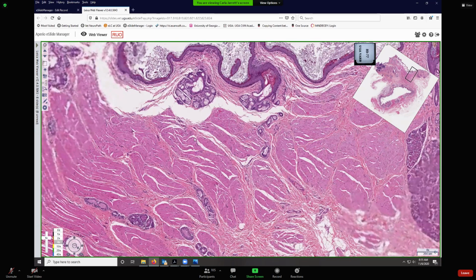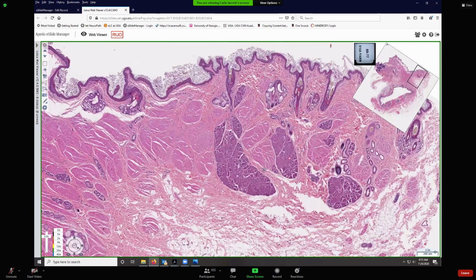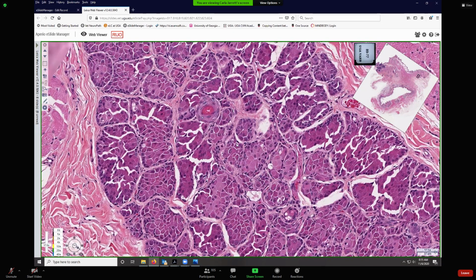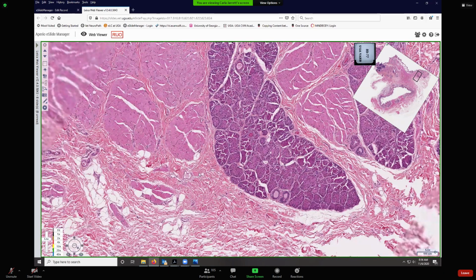And then over here, you've got your funky little modified sebaceous glands, your circumanal glands that look like little bits of Christmas stockings here. And how you tell that they're not usual is that they look different. They've got all these canaliculi-looking spaces around the individual cells, and they're not as foamy. They're not as filled with lipids as you would expect in a sebaceous gland.